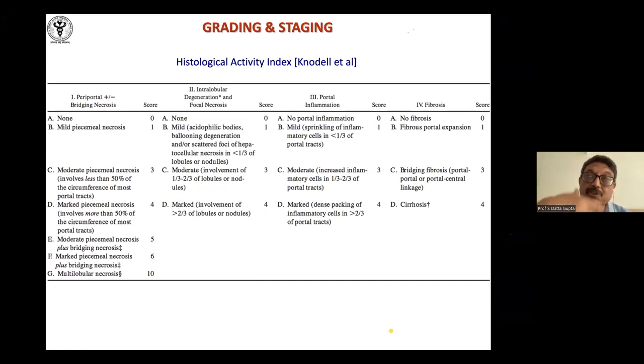So an attempt was made on how to grade. Can we grade it as less or more inflammation so that we can compare the same person's biopsies as the disease progresses, rather than two people, because there's so much sampling variability? Can we also tell, because the end result of inflammation is healing and repair, and in the liver, healing and repair results in fibrosis.